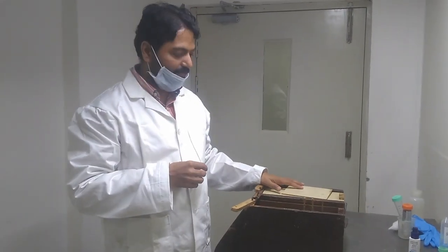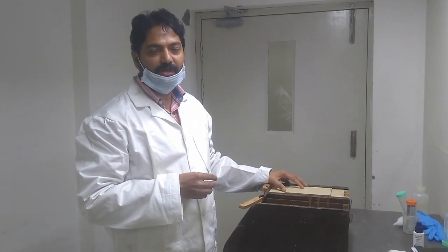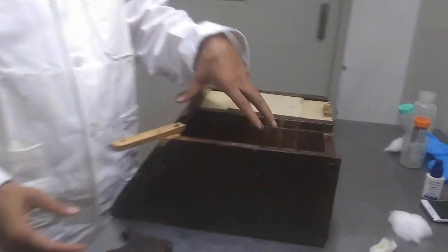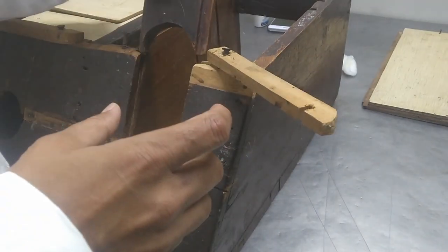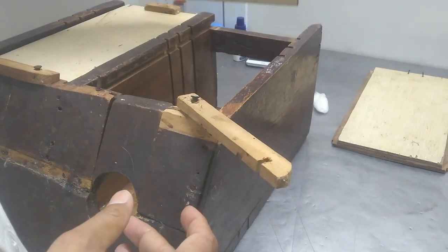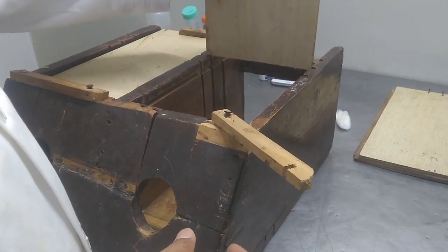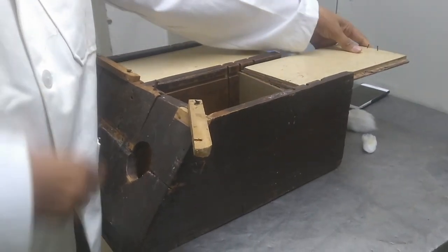When we have to bleed, we have to restrain the animal, because in general it is not advisable to anesthetize the animal. So we use this wooden restrainer, where we keep this rabbit, keep its neck here inside and the head outside. Then we restrain its neck using this, and we restrain the rabbit from the back side using these kinds of cassettes according to the size of the rabbit. There are 3 slots given, and after using this we restrain the animal from the top like this.